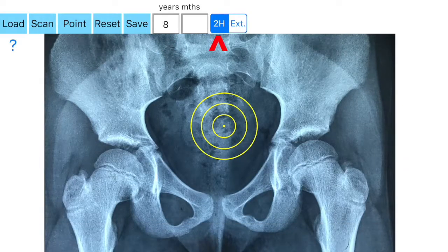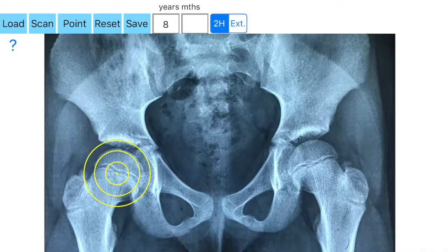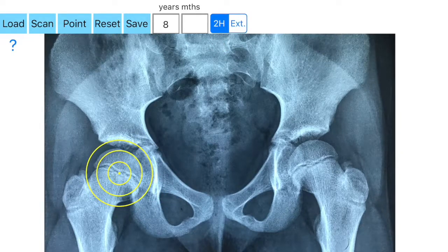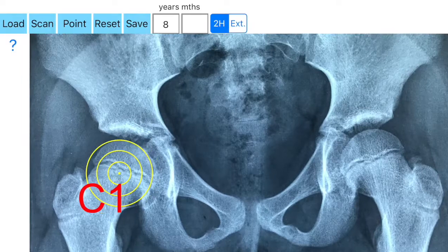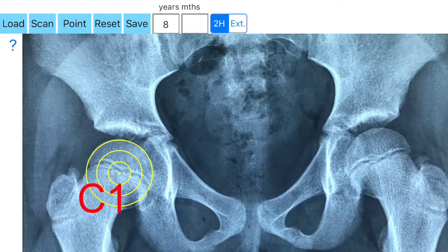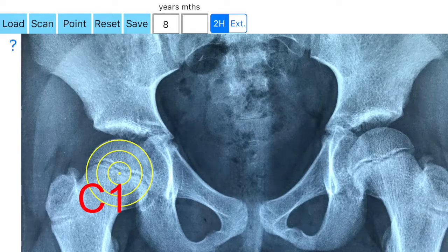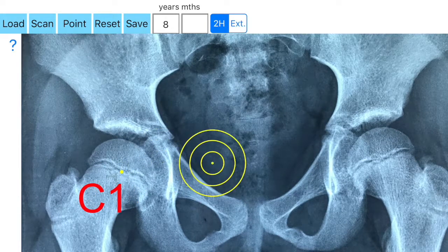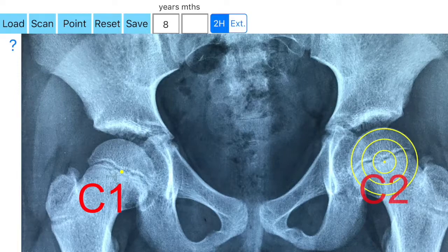Your aim is to locate the first point at the right hip. By clicking the point option, the center of the femoral head is marked and is the first point of measurement, C1 right. By repeating the same task, you locate the center of the left hip, C2 left.